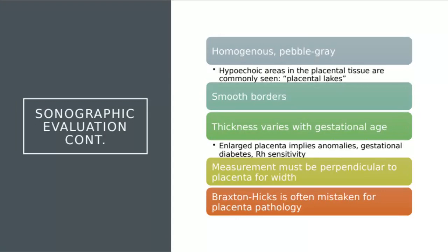So it's your uterus starting to go through that motion of contraction, and your placenta undergoes that as well. So you can actually see Braxton Hicks occurring in the placenta. Now, they're not super painful for the mom, but they just feel this kind of tightening of their belly happening, tightening of the uterus happening. And when we see them in the placenta, they look like a focal mass in the placenta, but all it is is the placental tissue grouping together and starting to squeeze on itself.